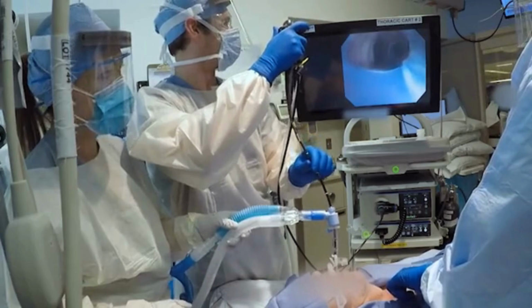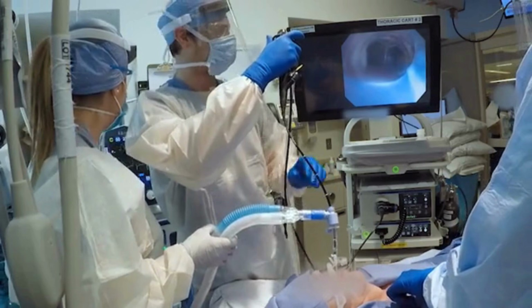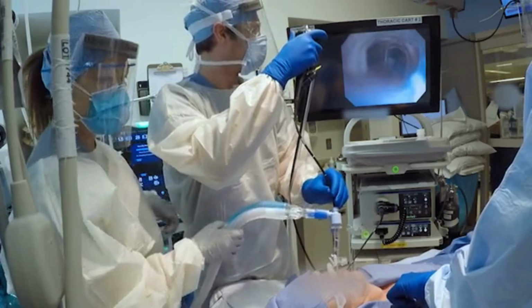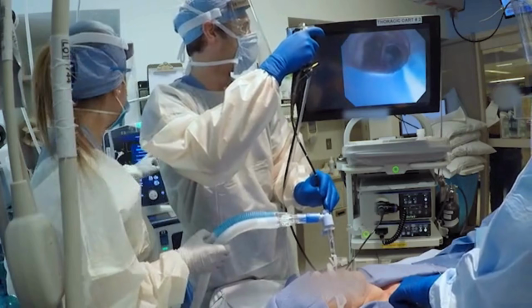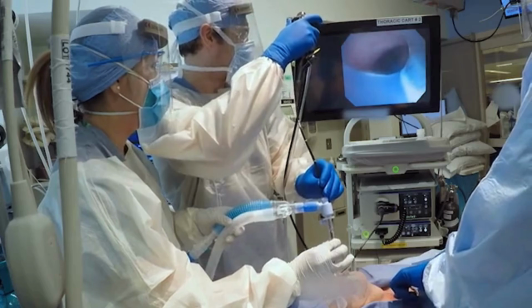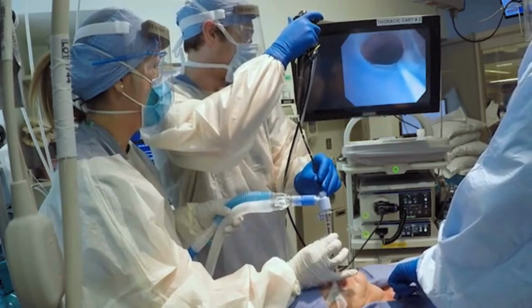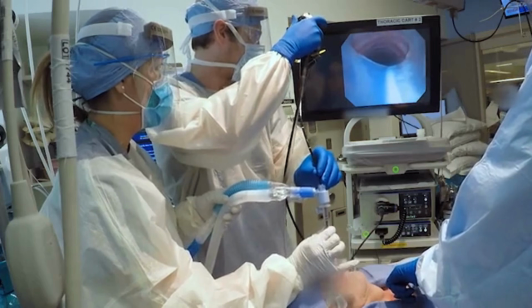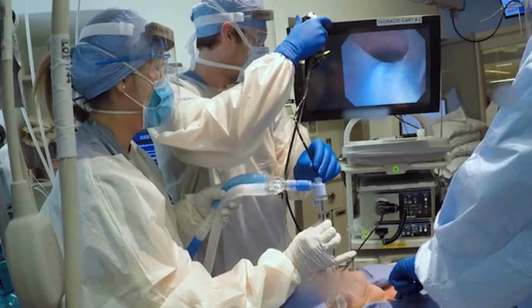The respiratory therapist should then induce apnea again. Next, the respiratory therapist deflates the oral endotracheal tube cuff. The therapist and bronchoscopist then slowly withdraw the tube and bronchoscope together until subglottic landmarks are visible. Surgeon palpation of the anterior trachea can aid in landmark identification. Keep the bronchoscope inside the oral endotracheal tube to ensure airway control. Precise communication and coordinated movements between the therapist and bronchoscopist are crucial to prevent accidental extubation.